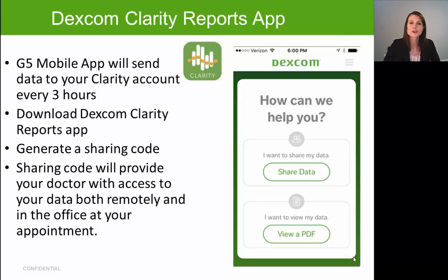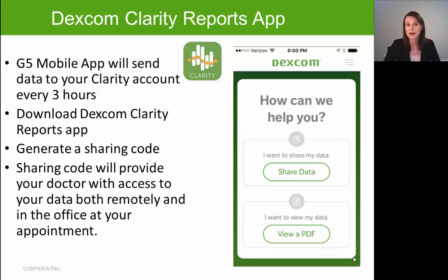Lastly, we'll review the Dexcom Clarity Report app. Clarity is the software you and your physician use to retrospectively review your glucose data. Your G5 app sends your glucose information to your Clarity account every three hours on its own via your phone's internet connection. When you download the Clarity Report app and open it for the first time it may automatically log you in, but if it prompts you for a username and password, use the same credentials you used for your Dexcom G5 app.